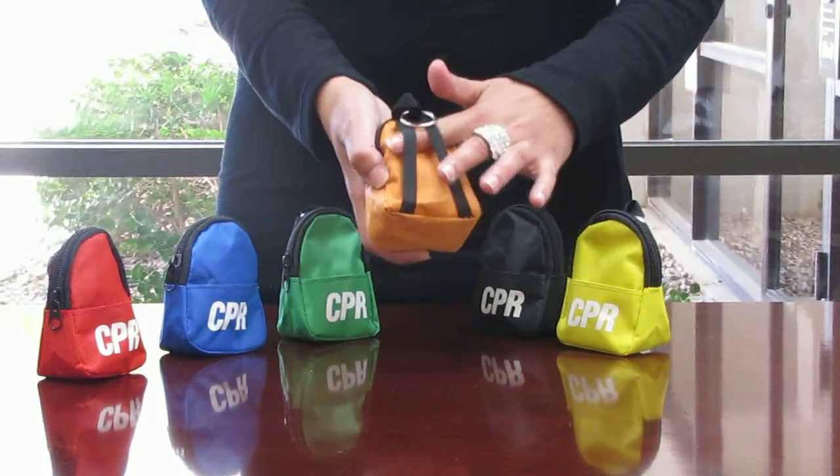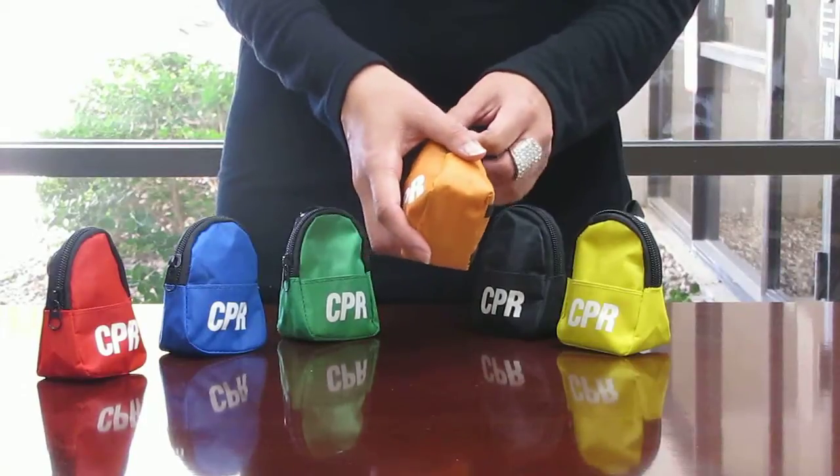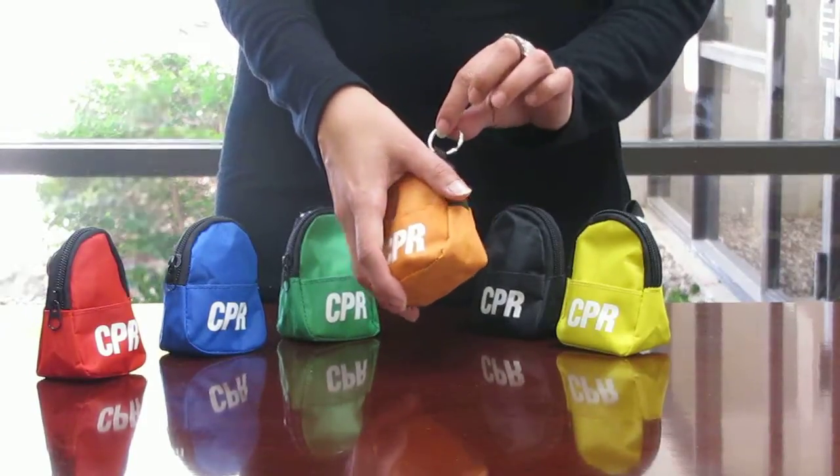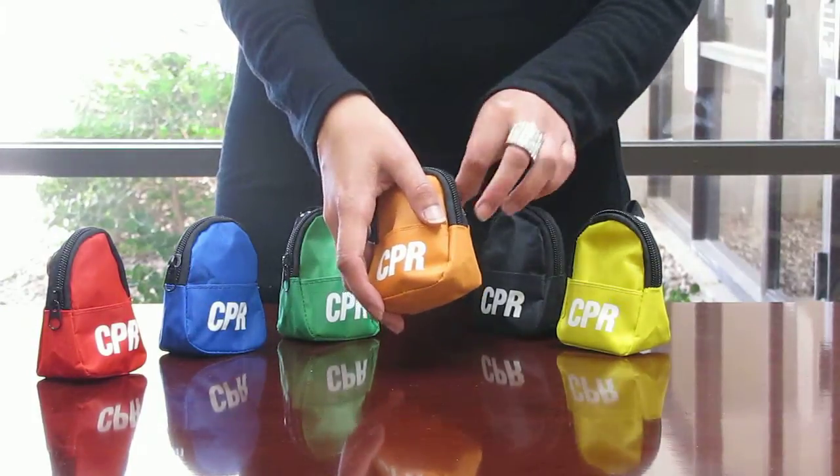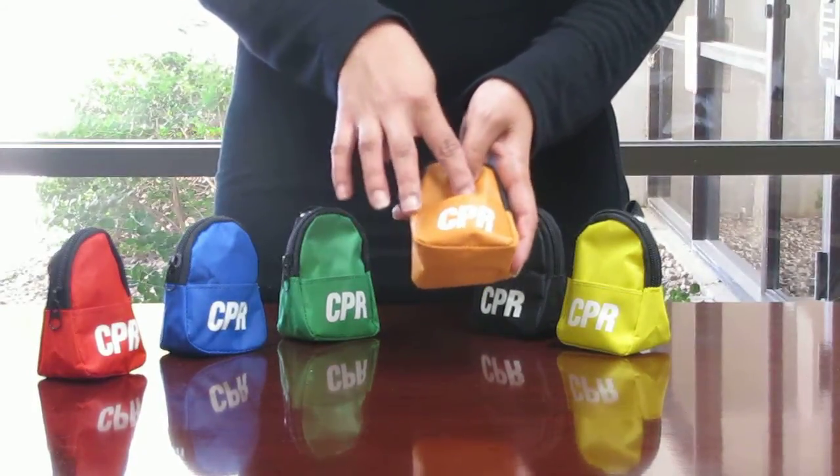These straps can be used to attach to your belt loop for quick access, or you can attach the CPR Savers backpack to your car keys via the key ring. The CPR backpack has a small front pocket.